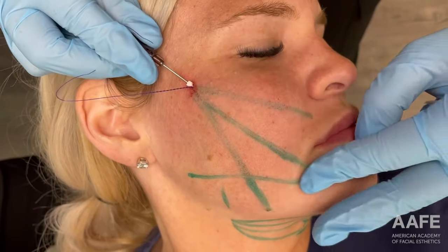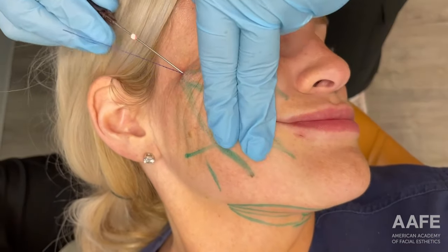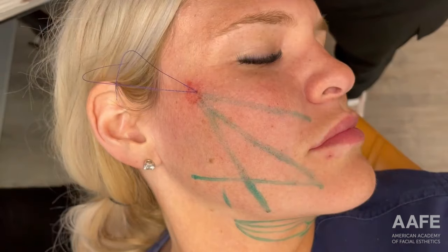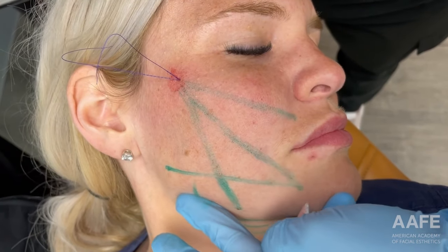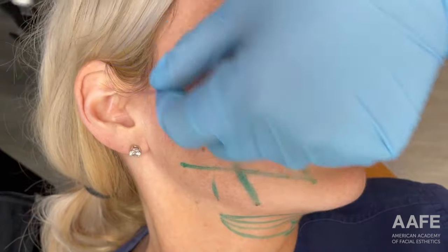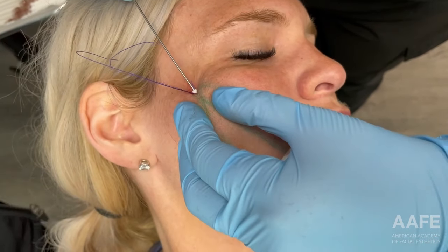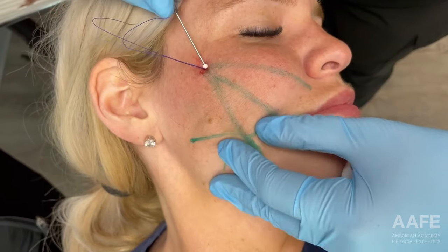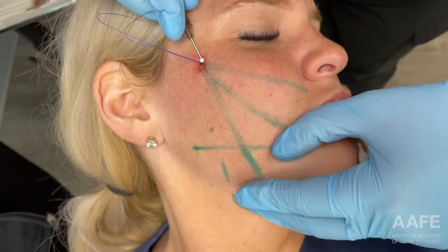If I were to identify that I was in the wrong plane, generally we can correct it before it's much of an issue. You could always abort the thread if you needed to. You can see I'm really exaggerating the lift as I exit here. I have marked her facial artery — you obviously want to avoid that. I just like to check again that the placement hasn't moved now that she's lying flat. When you're in the proper plane, this just glides pretty easily. Occasionally you can meet resistance near the ligaments, but if you're in the right plane, it's going to go pretty smooth.